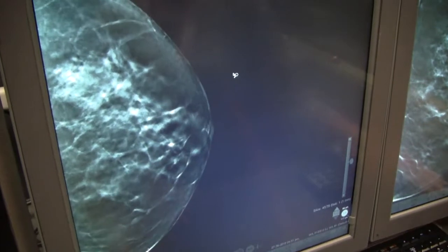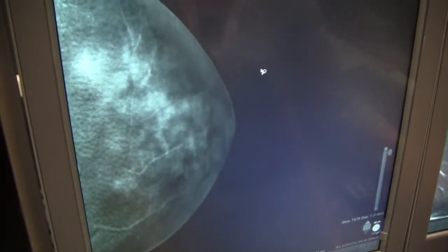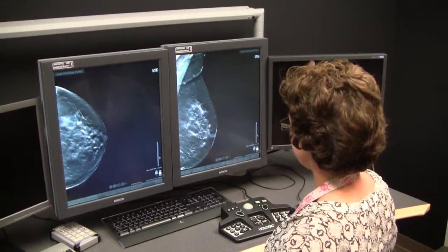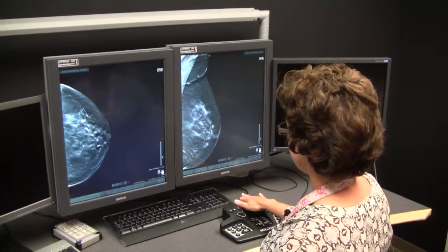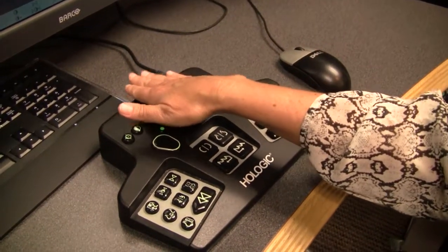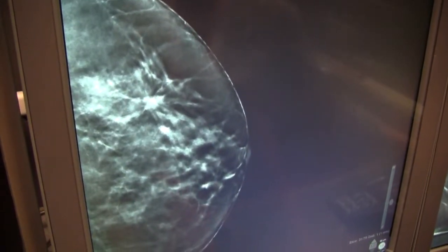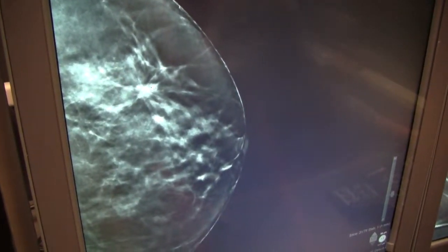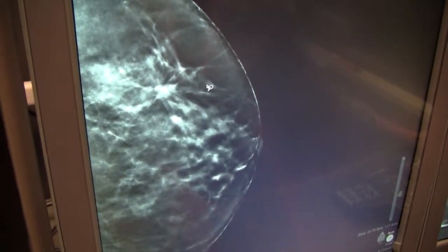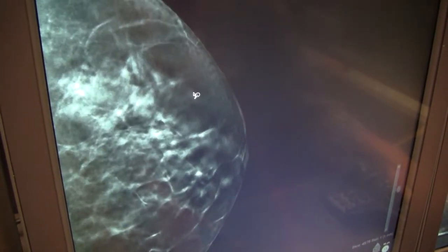This is a patient's breast that has had a 3D mammography. And so basically we take the images and it's reconstructed into 1 millimeter thick slices throughout the whole breast. And so that dense tissue that could obscure a mass is now not going to be obscuring so many things. So we can see right here there's actually a little mass, right? This is what we would consider a mass with these little spiculations coming out of it, which very easily could be obscured on a mammogram with 2D technique.